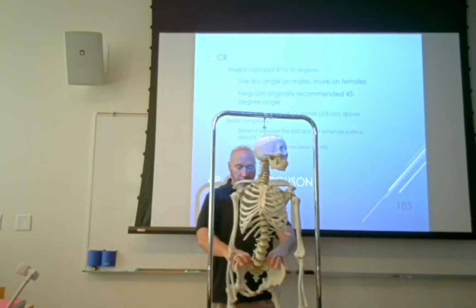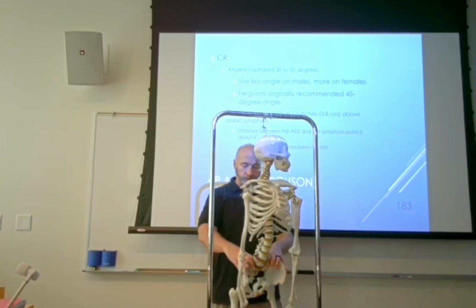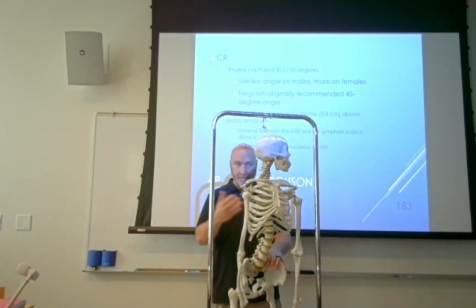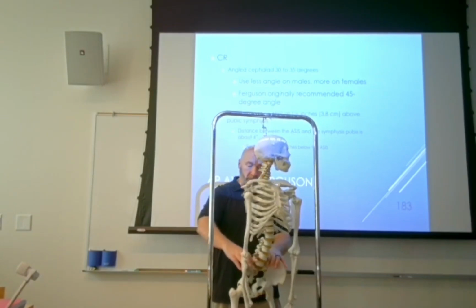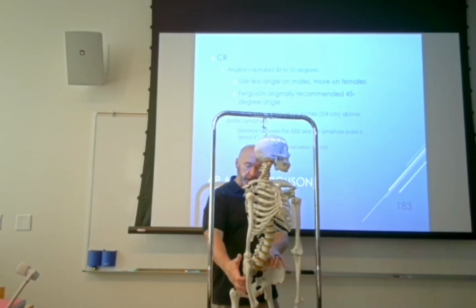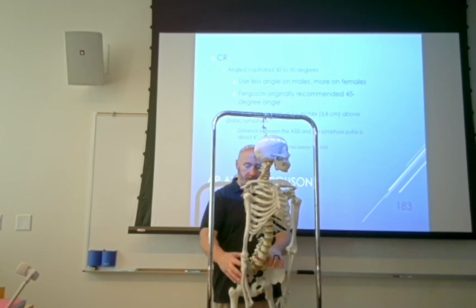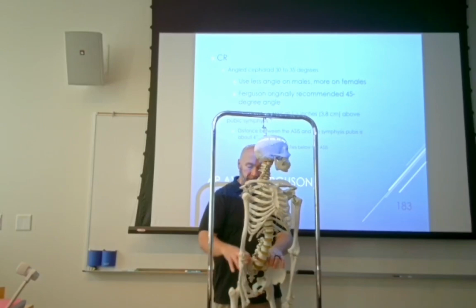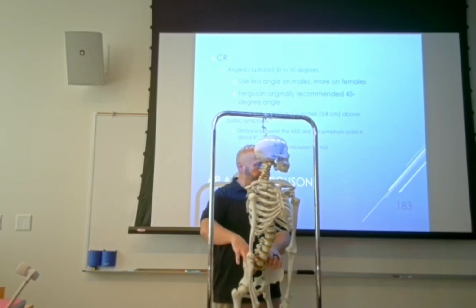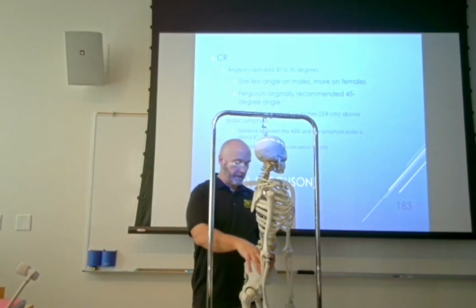So in order to visualize them in any kind of frontal view, it's going to have to be an AP oblique, and we're going to see the elevated side, the upside, right? So what we're going to do is elevate, and then look what happens as we just shallow oblique this guy. It's like 20 degrees, 25 degrees. And look at where your elevated ASIS is in relationship to the SI joint.